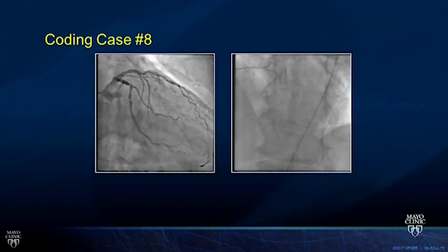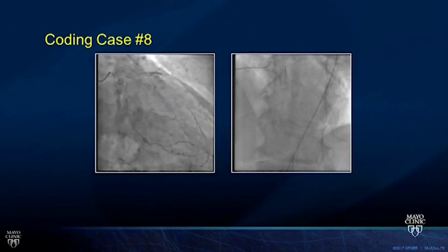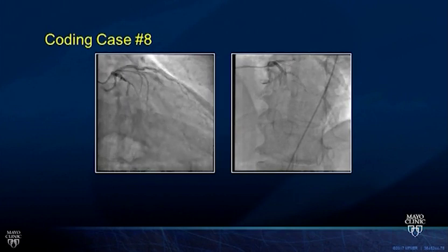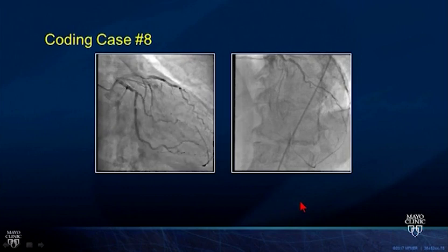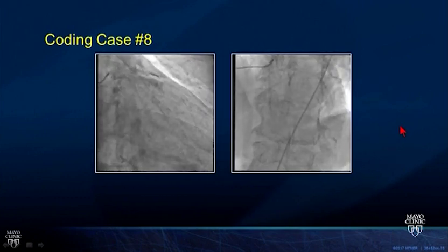Here's another case. There's a caudal view, and on the right here is an LAO cranial view.